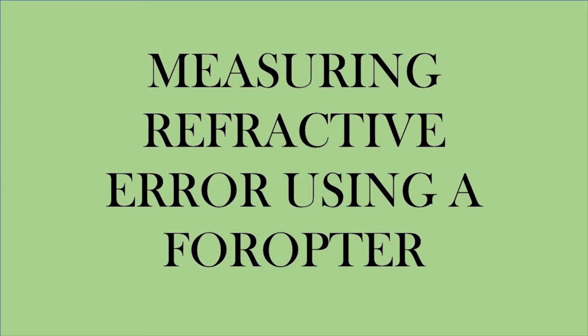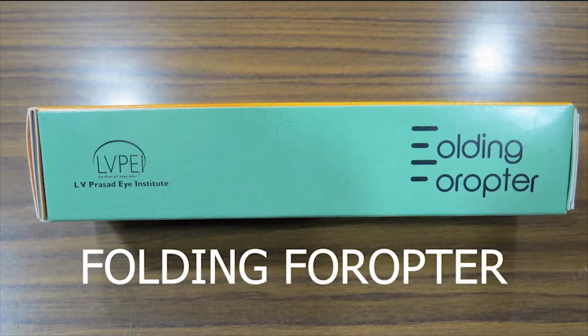Measuring refractive error using a Foropter. You will need the folding Foropter, observation card.